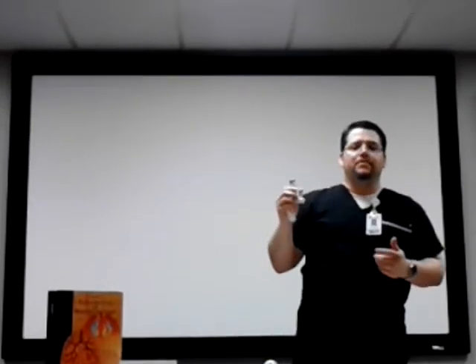After it's shaken up, we want to actually prime the medication. That means squirting it out of there. And if you see how forceful that medication is coming out, you'll notice that if you put this directly in your mouth, it would actually hit the back of your throat, and moisture would stick to moisture, and medication that you would not receive because it's sticking to the back of your throat.